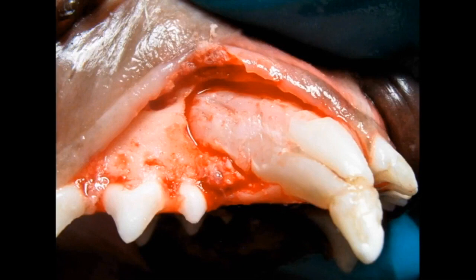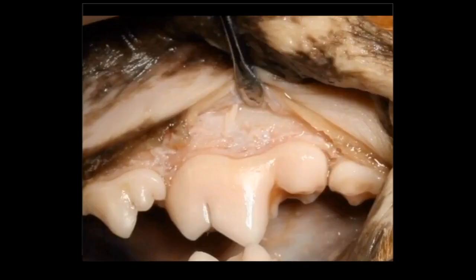Let's go back to the first molar. Here's the flap exposure we would recommend for extracting that tooth. You can see we've got great exposure — the crowns are facing us and we can see the bone really well. We're now prepared to remove bone with our burr to facilitate the next step in the extraction.